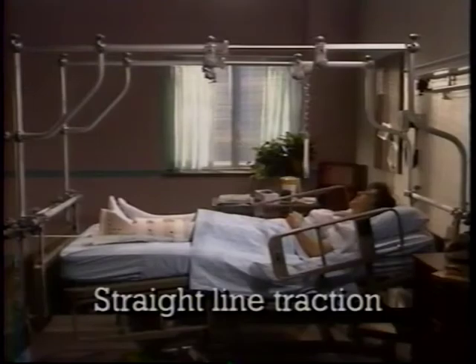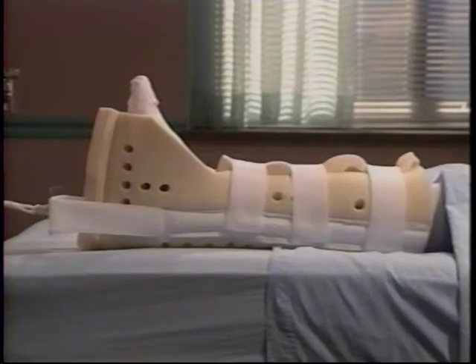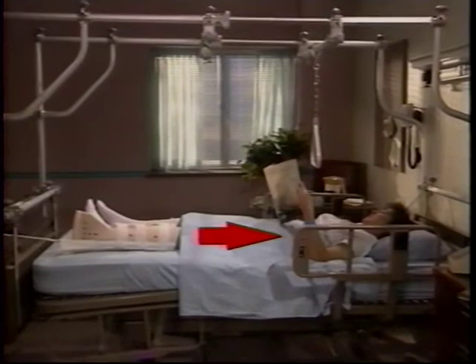Straight line traction has the pulling force applied in only one direction. It is one of the oldest and simplest forms of traction and is most commonly seen in Buck's traction. This traction is affixed to the limb at only one point and then is attached to a weight using one or more pulleys. The patient's own body weight provides the countertraction.